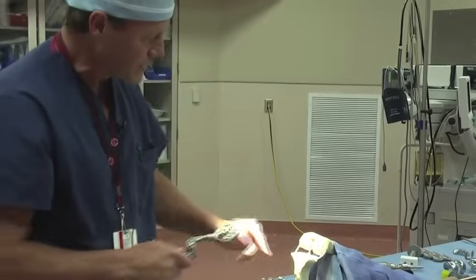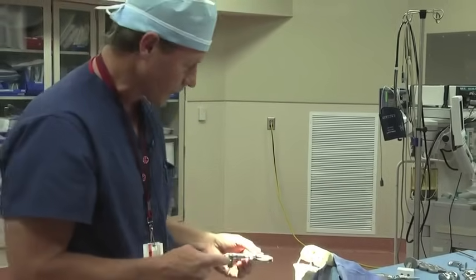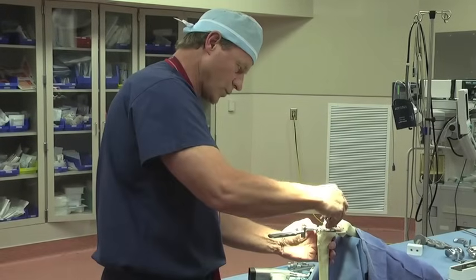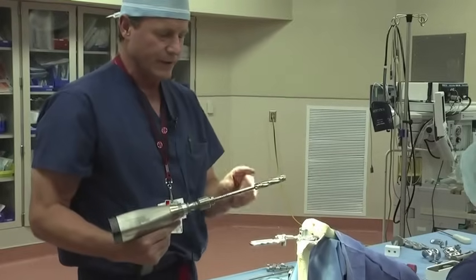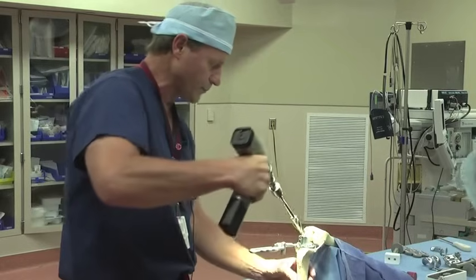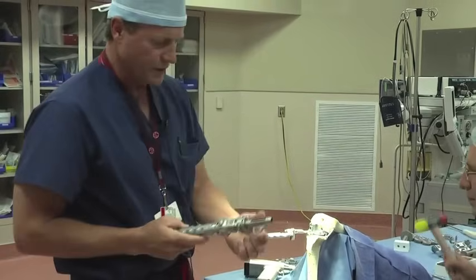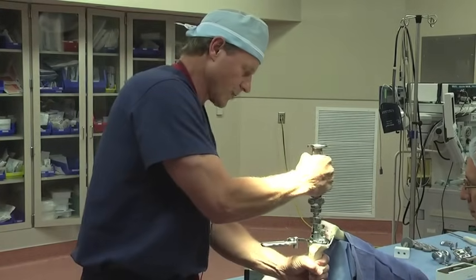Similar to the femur, we want to measure the size of the tibia. We have multiple sizes to mix and match so we get the perfect fit for the patient. The next step is to pin the sizing guide in place. We have a little tower that goes onto this, and we'll put this in place and go down to the depth indicated on this reamer to make the hole for our stem that goes on this particular component. Then there's a punch with fins that matches up to what we'll put in for our final implant.